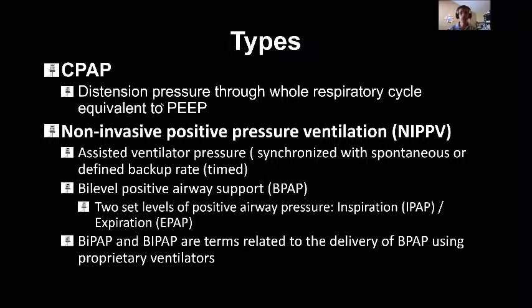So CPAP is continuous. The other way to provide non-invasive ventilation is non-invasive positive pressure ventilation. Positive pressure ventilation means you have two phases. Remember, in CPAP we have only one phase through the whole respiratory cycle, while non-invasive positive pressure ventilation provides two phases. And these two phases can be synchronized or not synchronized.